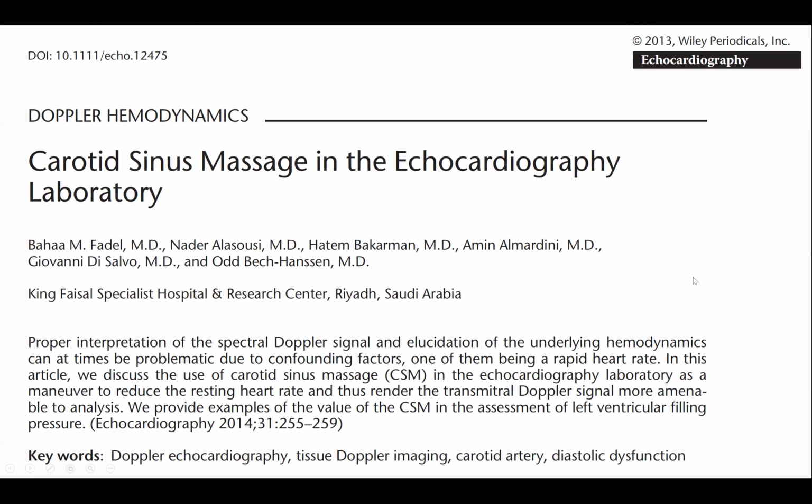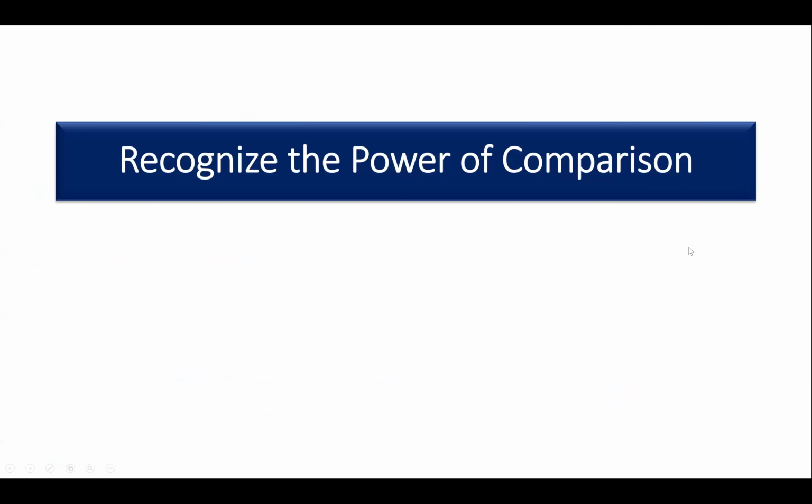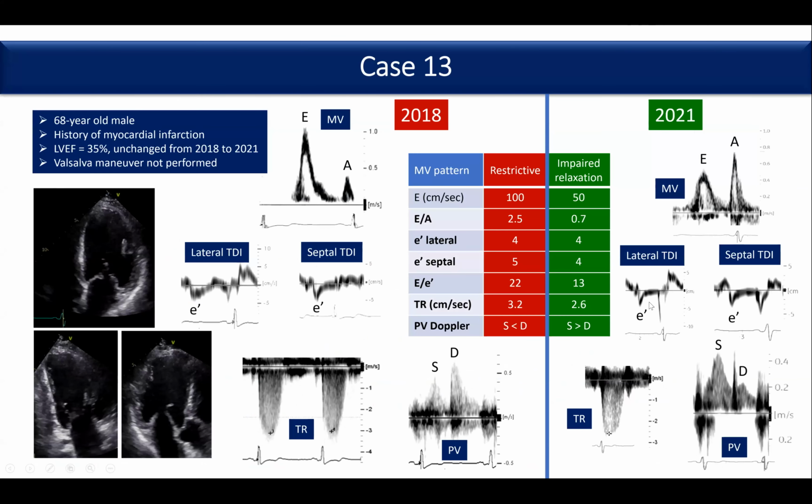So it's really useful telling us what to do, kind of beyond the guidelines. Now, what I want to share with you as the last part of the talk is recognize the power of comparison in echo. And this power of comparison is tremendously important for your patient. You have to compare current studies to previous studies. And I'll show you an example of the power of comparison.